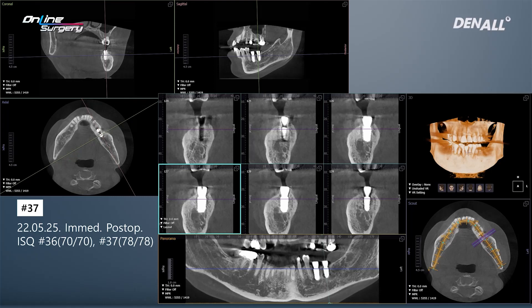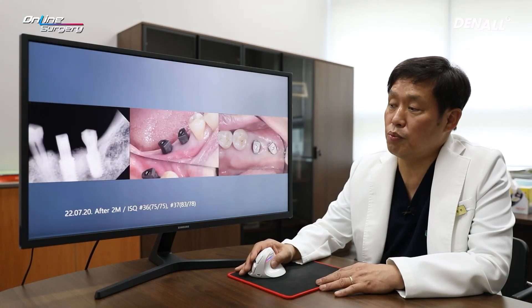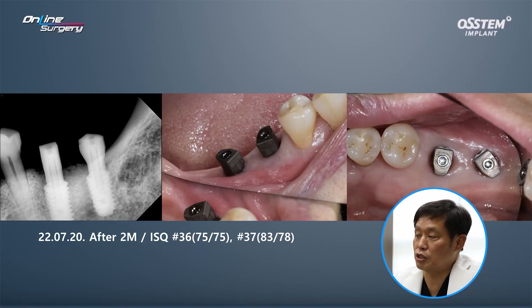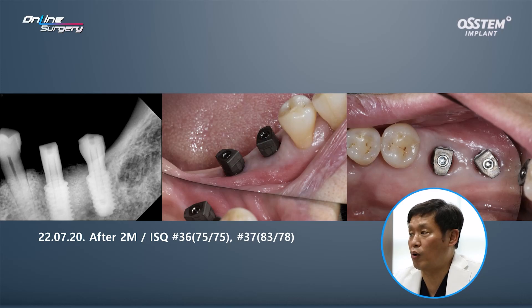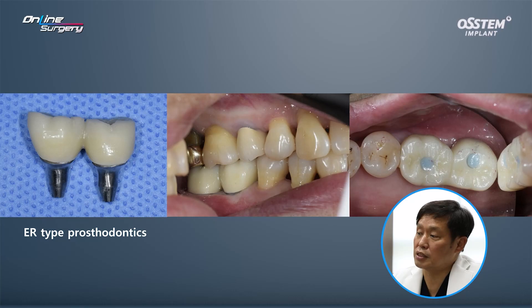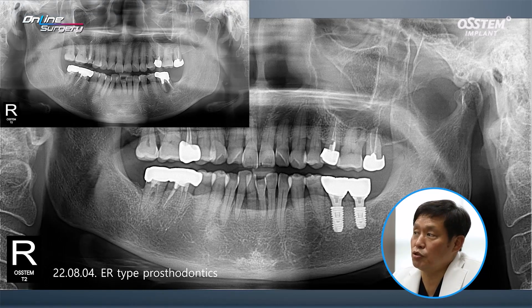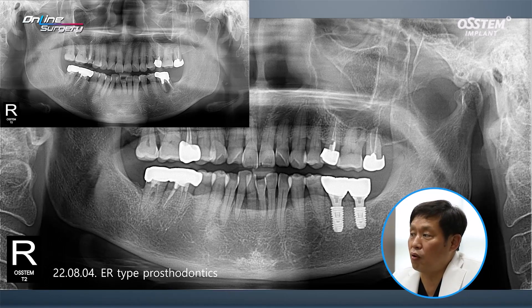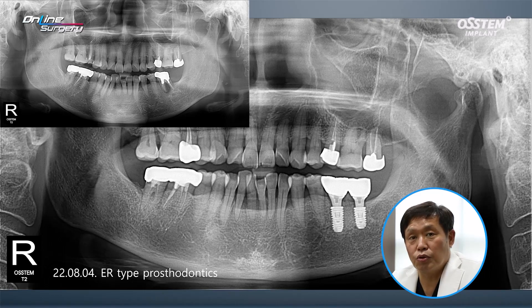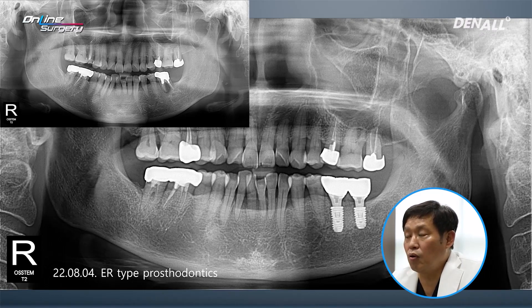In number 37, this is the CT image after implant placement. After two months since implant placement, ISQ values were measured: in number 36 it was about 75, and for number 37 it was 83 and 78. Digital impression was taken and the final ER type prosthesis was delivered. Panoramic x-ray was taken. At initial visit in number 36, there was an apical lesion and alveolar bone was destroyed. Extraction was done and in the extraction socket, AOS was used for socket preservation with collagen membrane.